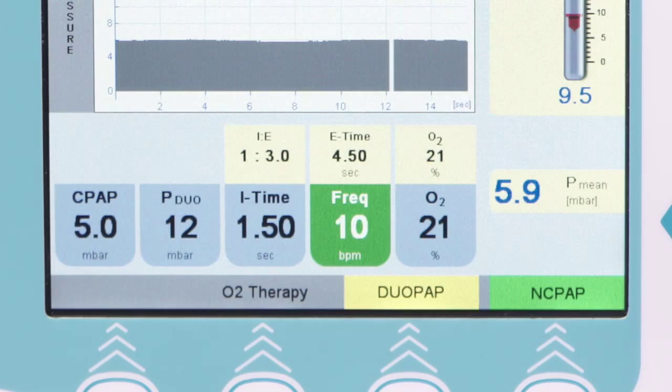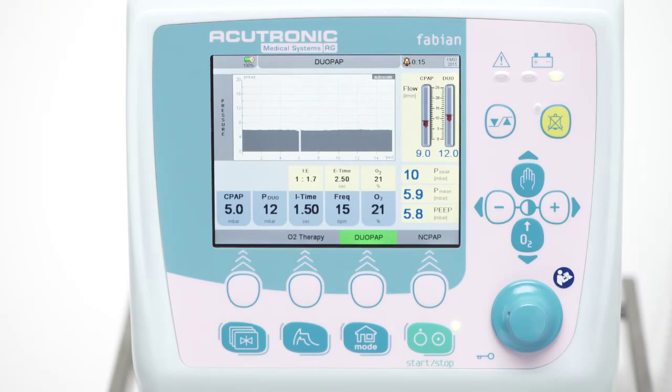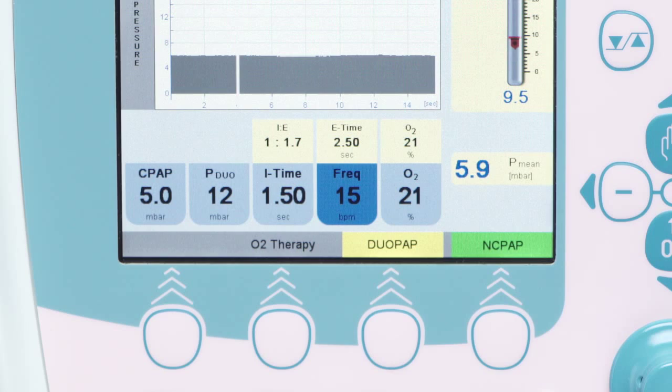Press the yellow DUO-PAP button again to activate the mode. Its color will change to green. DUO-PAP is now active.